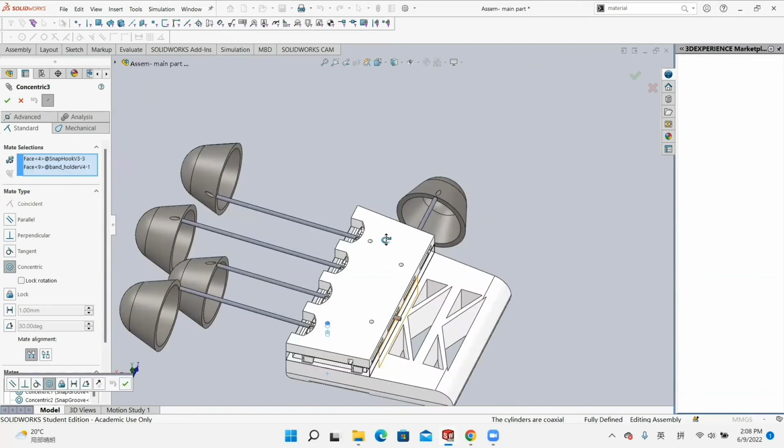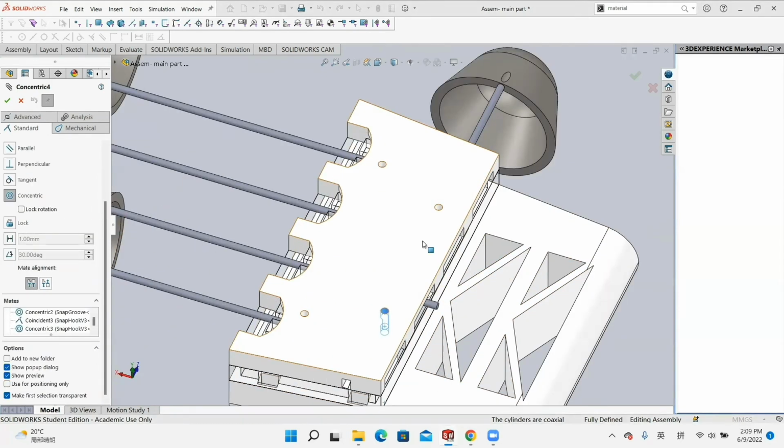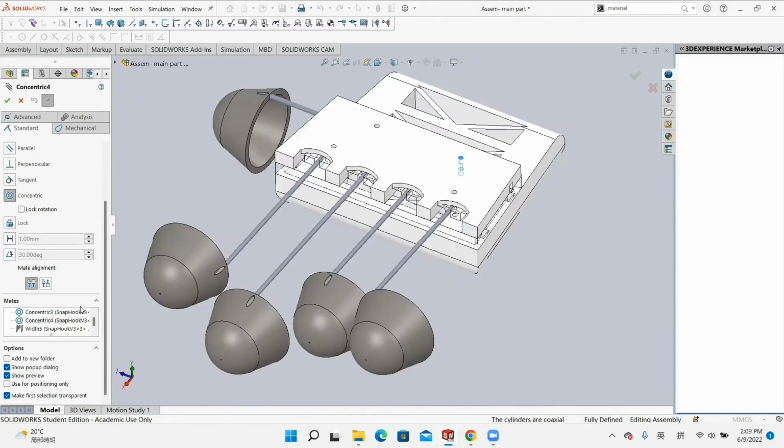And next step is the band holder and the snap hooks parts all have 4 holes for screws at the exactly same positions. So we use the concentric mate to make the 2 holes concentric. So select inner cylindrical face, do the same for one of the bottom holes. So make these 2 parts perfectly fit into each other.